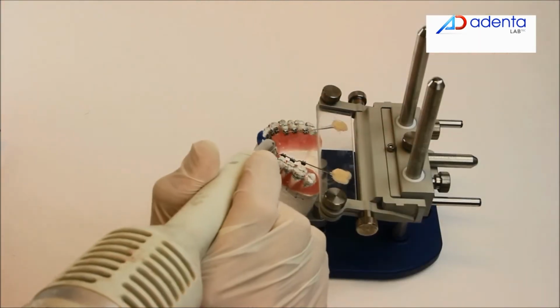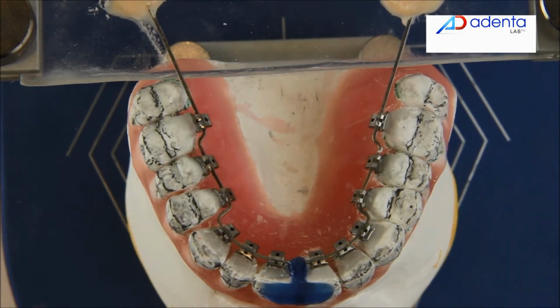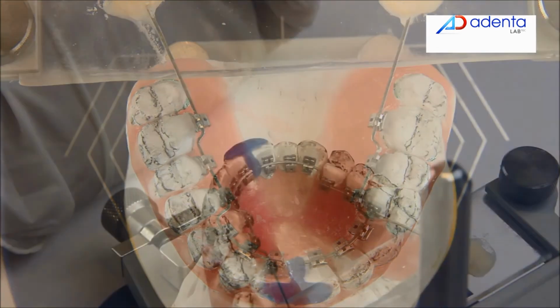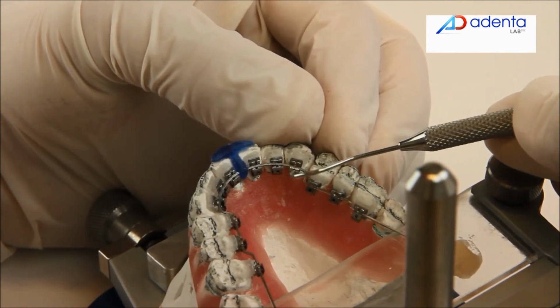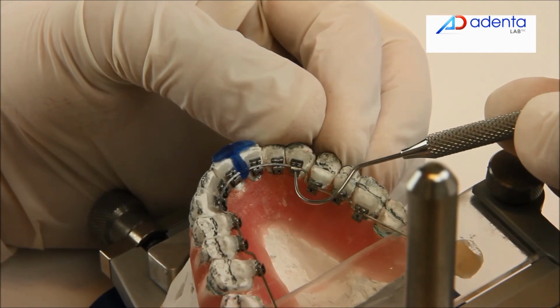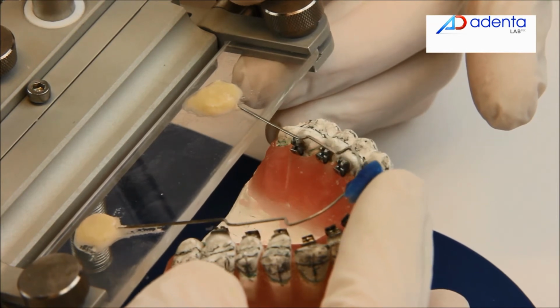When the composite base is finished and the excess removed, carry out the light curing. When the positioning of the brackets to the model is finished, open them and remove the arch and keep it until the end of the treatment for possible repositioning.